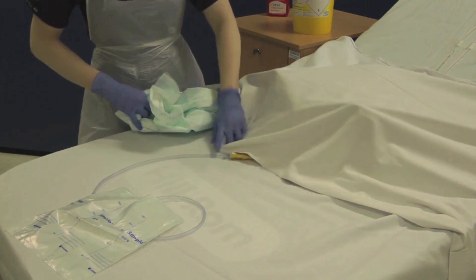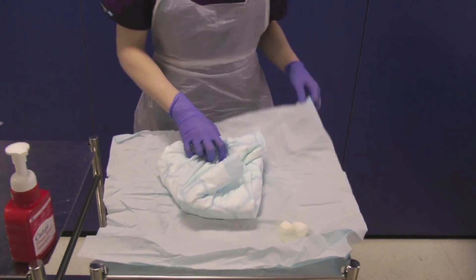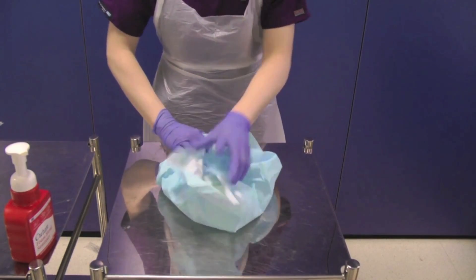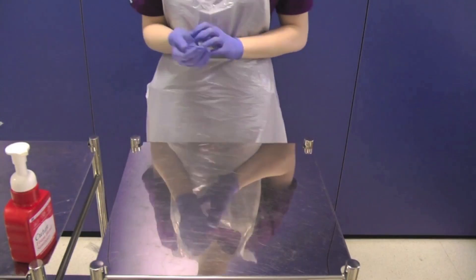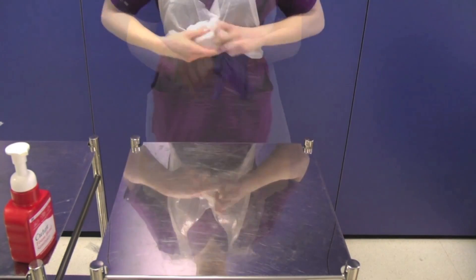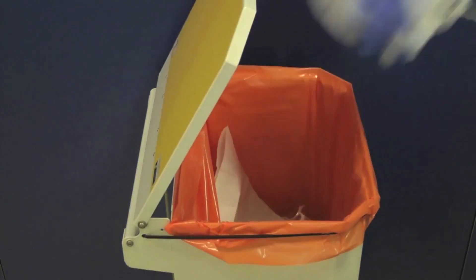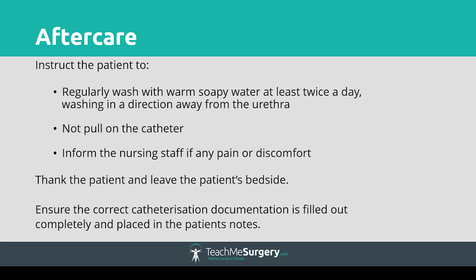Replace the foreskin and remove all waste material. Cover up the patient and return to your trolley. Wrap up and dispose of any remaining clinical waste. Remove your gloves and apron and decontaminate your hands. Thank the patient, remove any remaining clinical waste and decontaminate your hands.